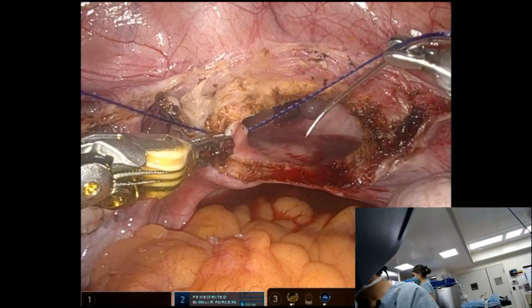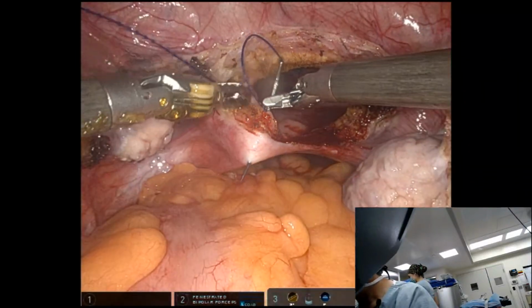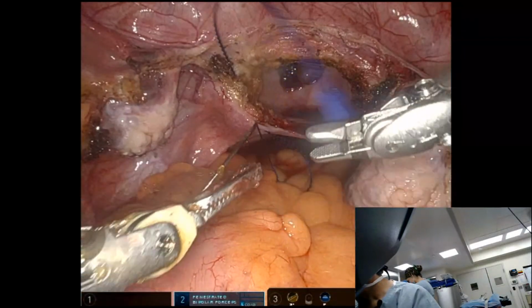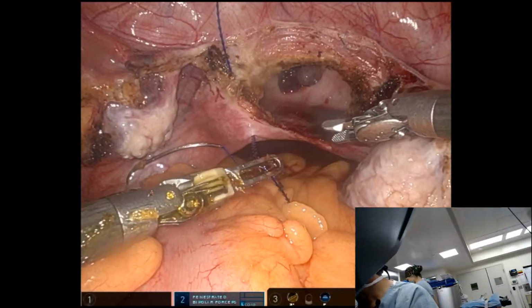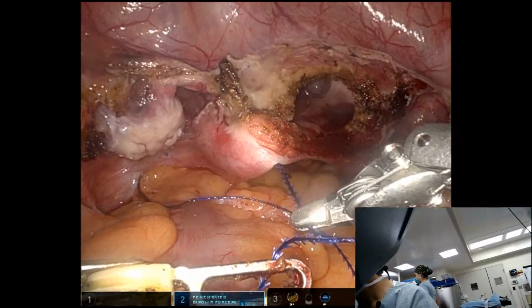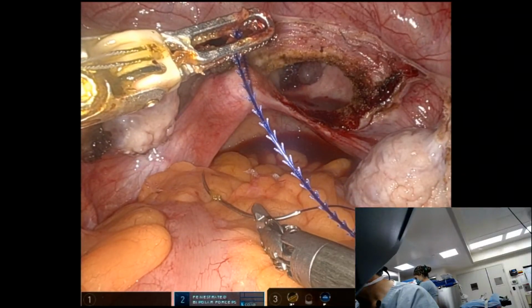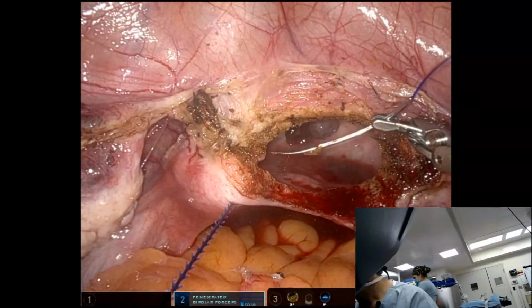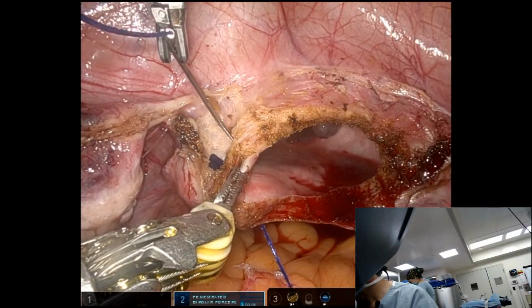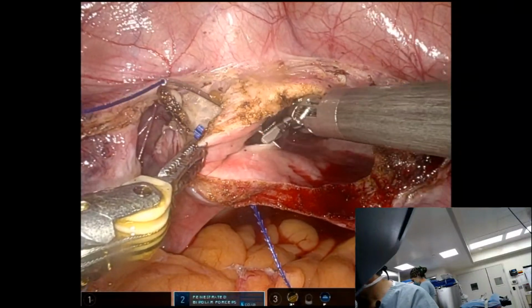It lasts for, probably say, 3 months. It's an absorbable suture. I think one of the important things here on the closure of the vaginal cuff is getting the angle. Getting the angles is very important.